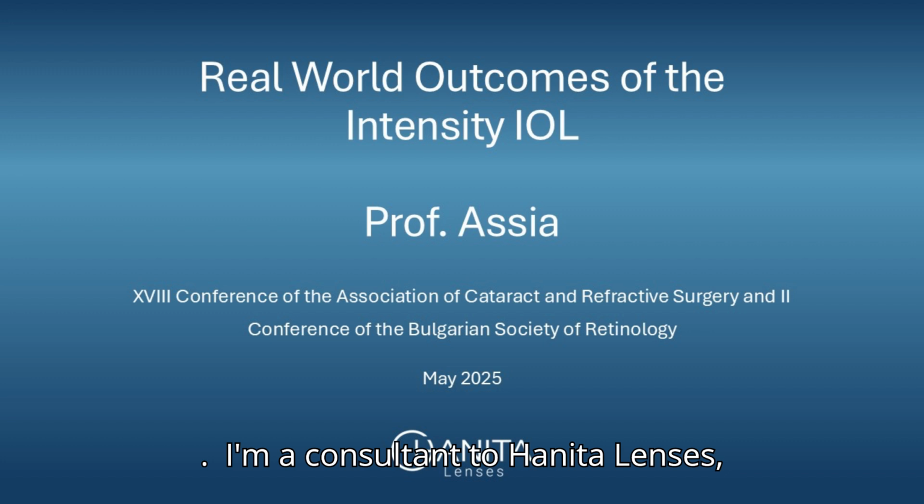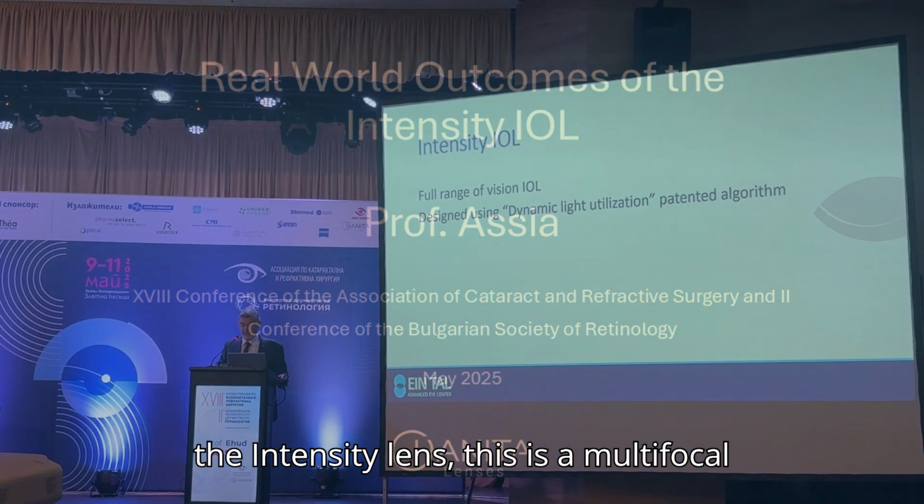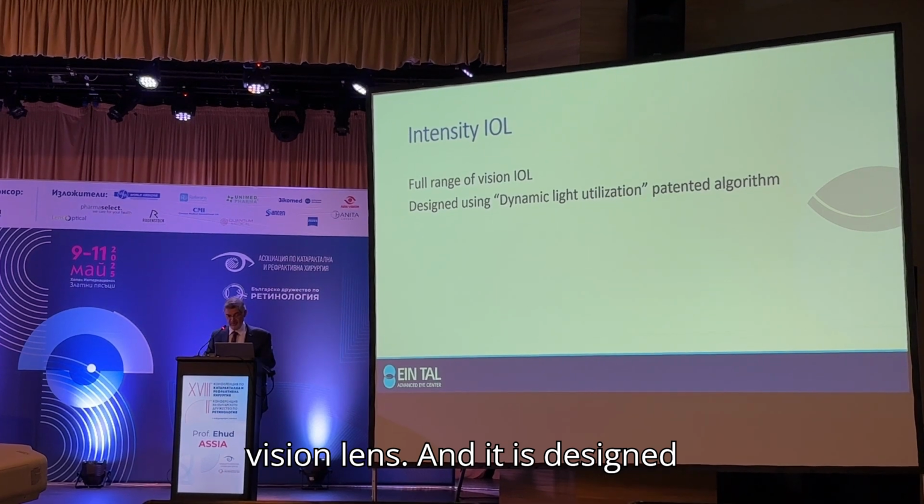Hanita. Once again, I'm a consultant to Hanita Lenses, so I will just need to acknowledge that. And the Intensity lens, this is a multifocal lens which should provide a full range of vision.